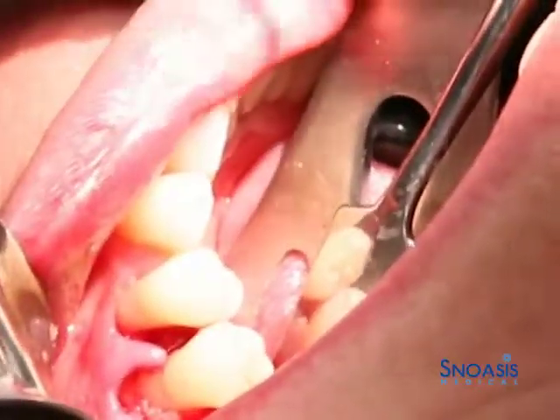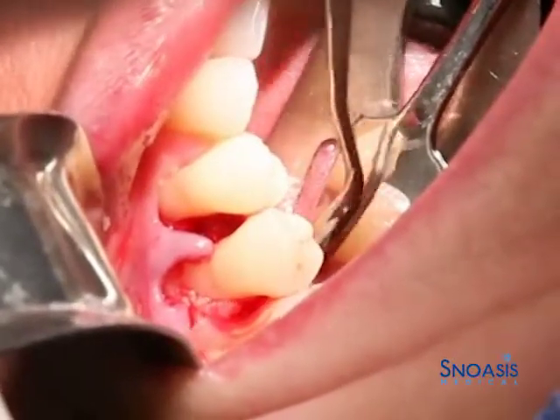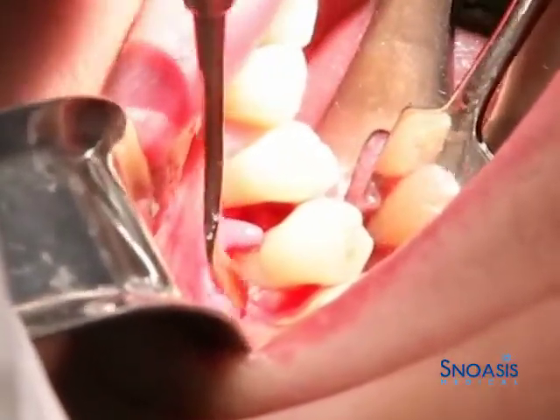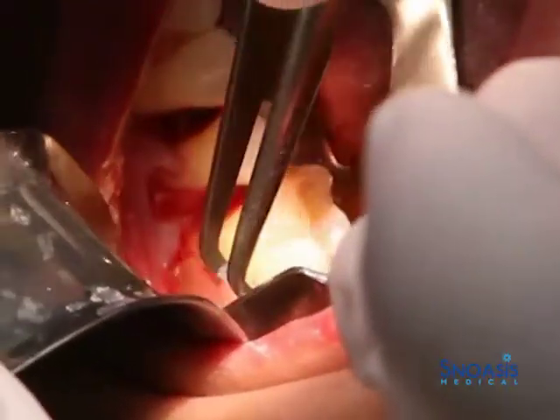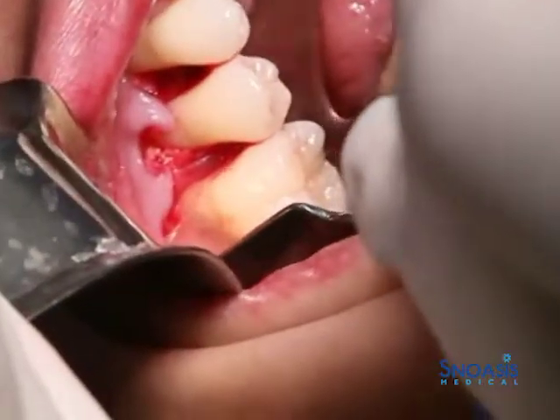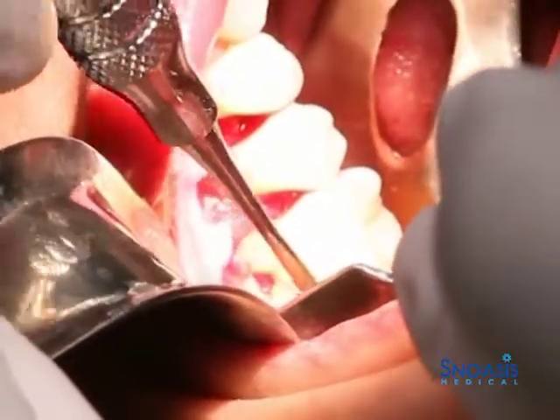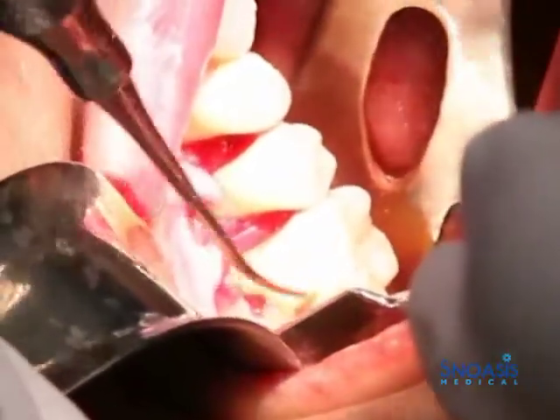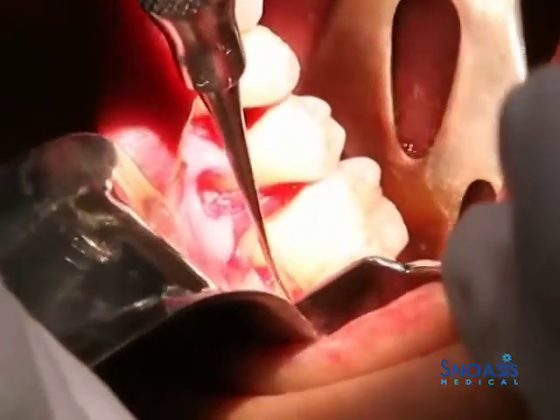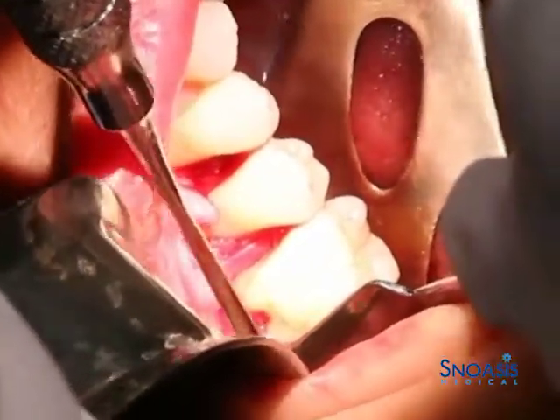You can see it going in one side and coming out the other. On the inside it's folded upon itself, which is fine — I don't mind if it happens because now I've got a double layer. We just get it in there and advance it through. As it hydrates, it just makes it a little easier to manipulate.